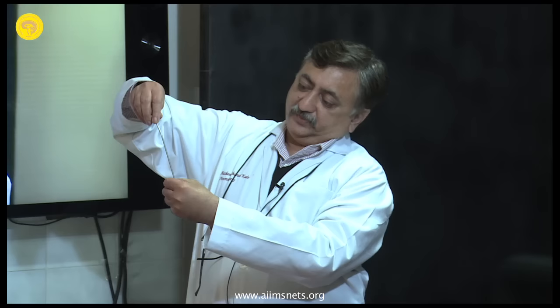The T12, T11 is almost straight. And for the lower lumbar, it starts getting medial, more medial than downwards. So this difference you have to remember, that the thoracic pedicle screws have to be angled downwards into the body, because you'll see the pedicles angling downwards. So that is one. Now the entry point of the thoracic pedicle, more or less the principle is the same. You have to see where the facet is, you have to see where the transverse process is, and the same lines hold true here also, except that the anatomy is not as good as in the lumbar spine.